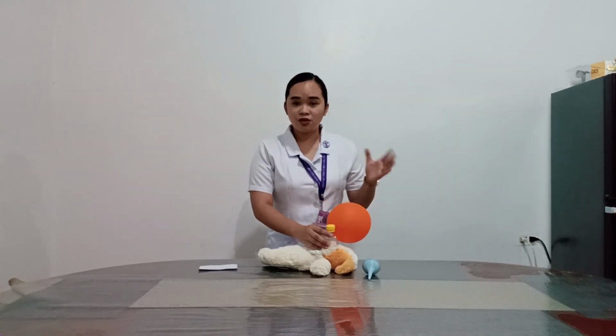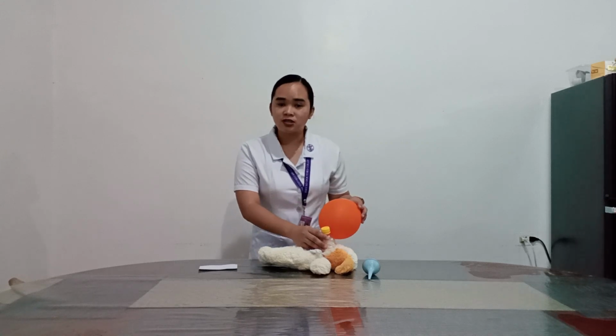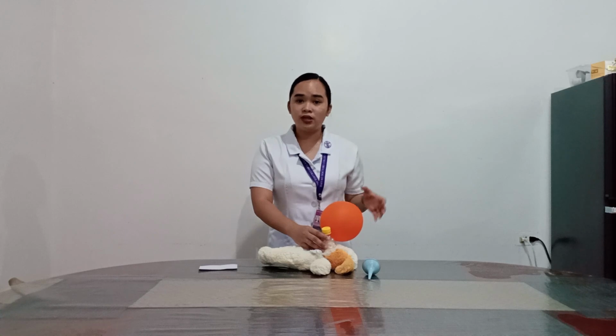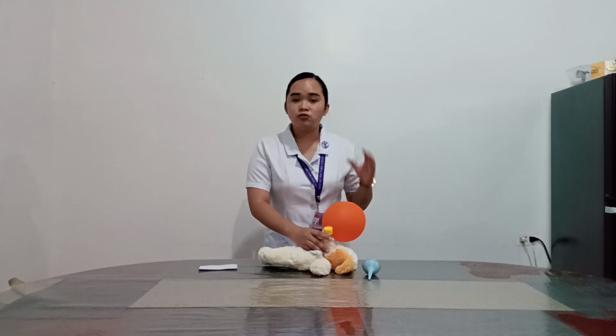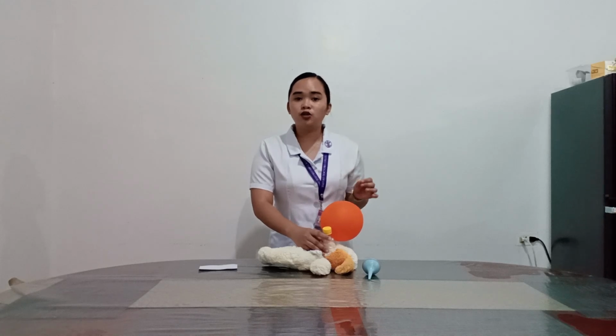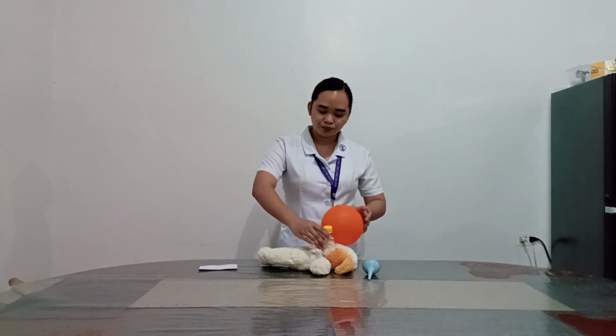So position the thumb and forefinger of one hand and then place it at the rim of the bag mask. This is to ensure a pressure seal, and then the remaining fingers will be placed on the jawline of the baby. This is done so that our hand is not leaning on the patient's eyes and not compressing the baby's neck and is supporting the baby's head.